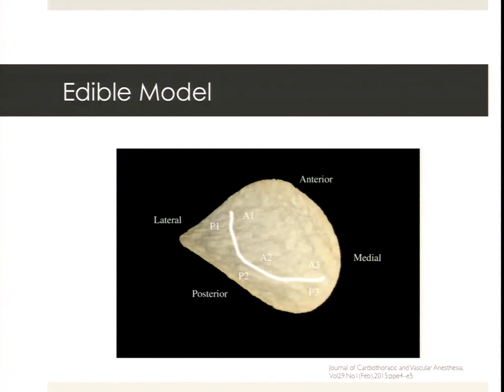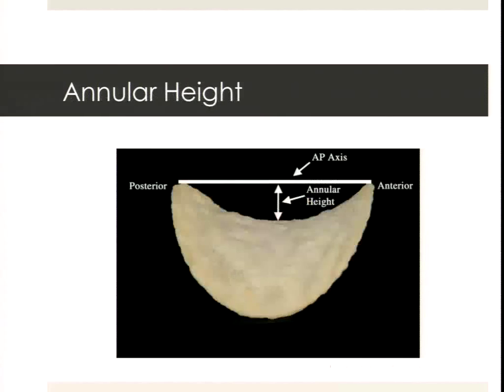So you need to think of what they're trying to do, what tools they're going to use to do that, and where your measurements are going, where the anterior and posterior elements are, where the medial and lateral elements are, how the commissures sit. And remember that when you're measuring annular heights, you're measuring a three-dimensional beast. You're not just measuring one plane.